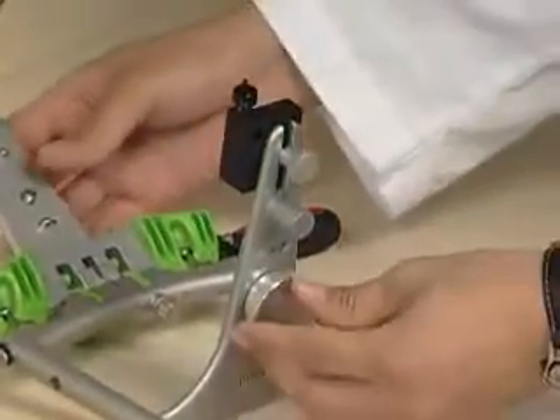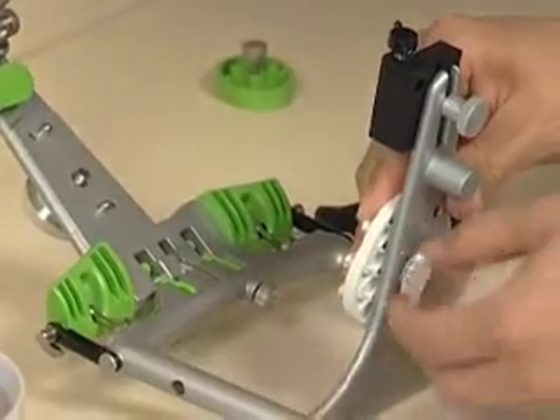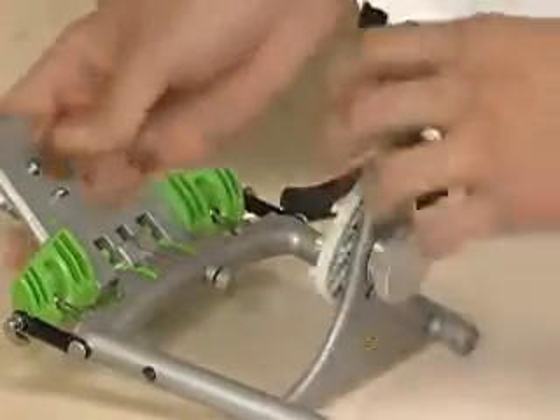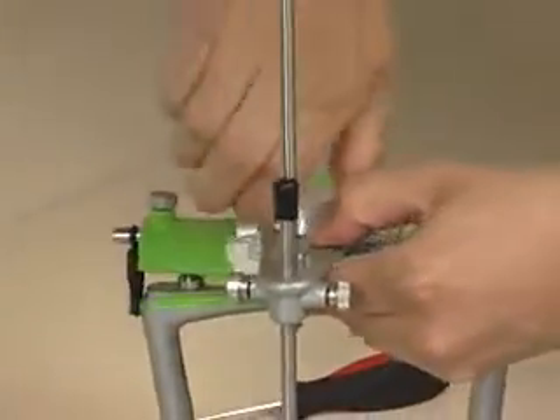Now we'll put in both the upper and the lower mounting plates. You want to tighten those very, very well on the articulator. Make sure they're seated properly and it's tight.